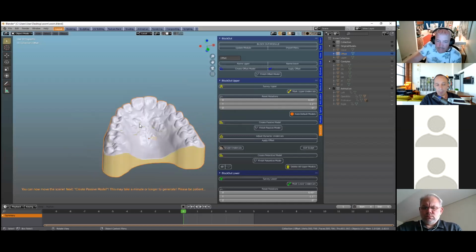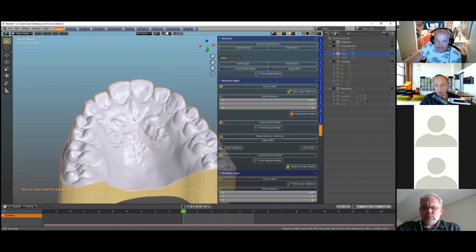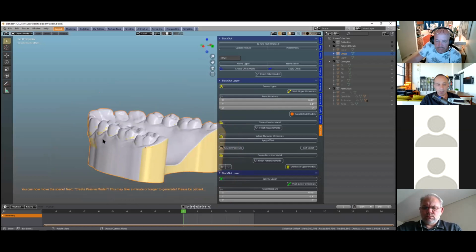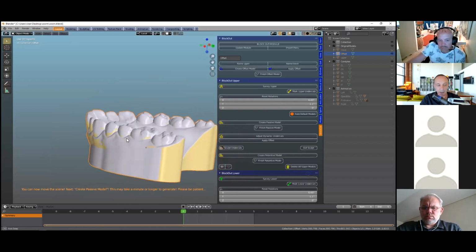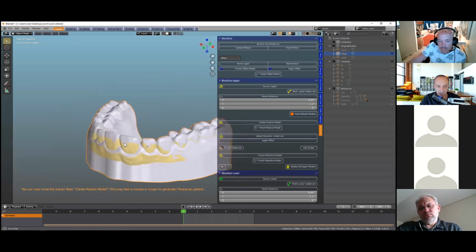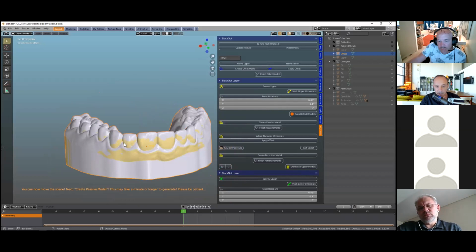Yeah, well, in the laboratory, we create that survey line, and we want to tuck the splint just under and into an undercut. So here we want to use maximum possible undercut. Sometimes when we make Michigan splints, just making a splint isn't enough.